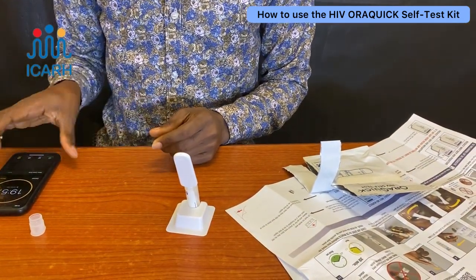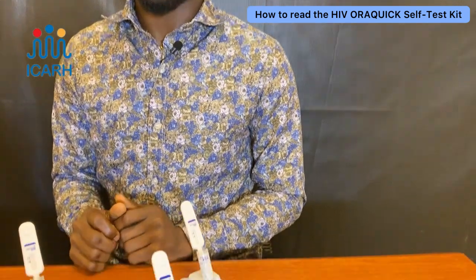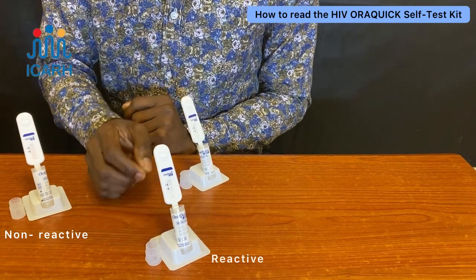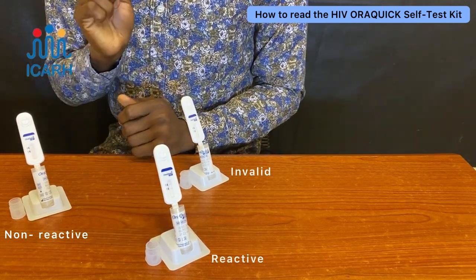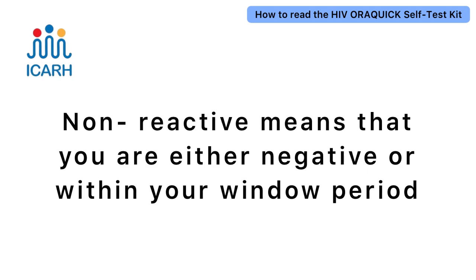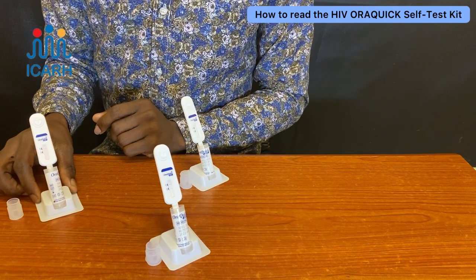Here we have three different results on the oral self-test kit: non-reactive, reactive, and invalid. I use the words non-reactive and reactive in place of positive and negative. Non-reactive means you are either testing negative or you are within your window period — the time where the virus is not yet visible on the test kit.